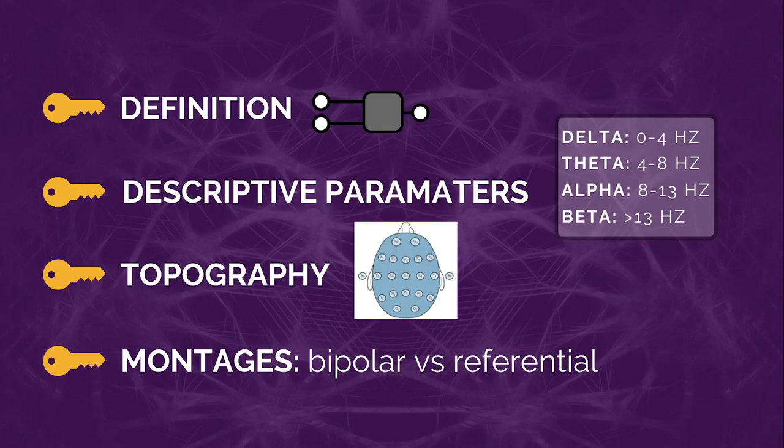Everyone, this is Fabio Nascimento, and today I wanted to go over basics of EEG. We're going to cover definition, descriptive parameters, topography, and different montages.